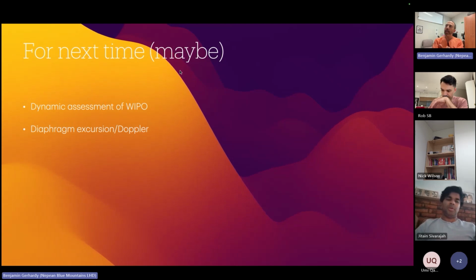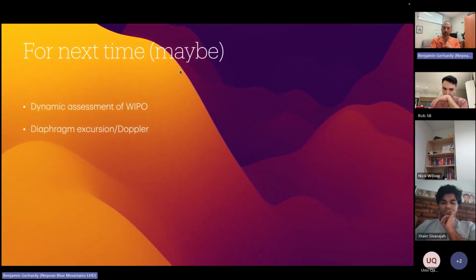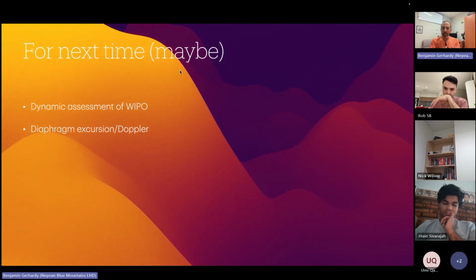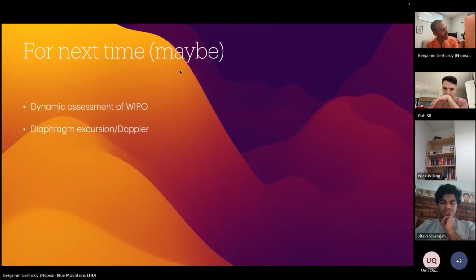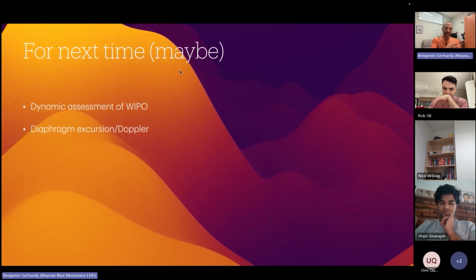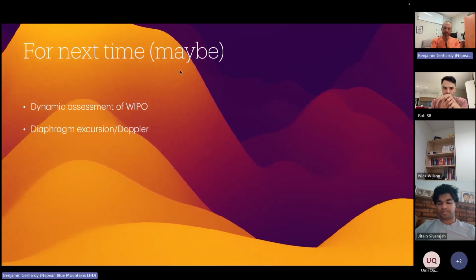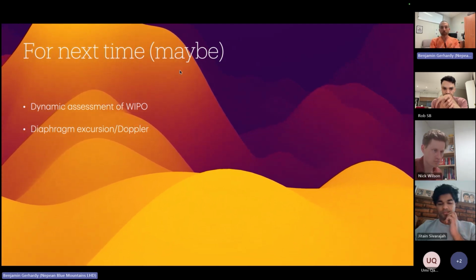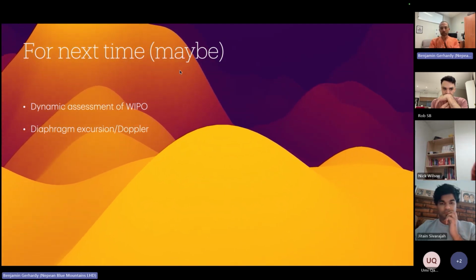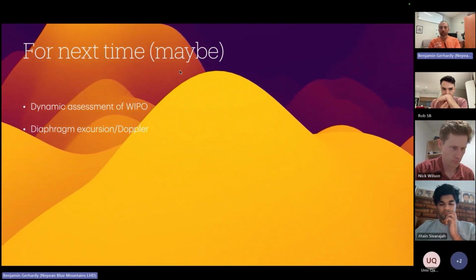The exceptions to that are if they had a really high Wells score, for example, or they just had a lot of features screaming PE, then I'd do a CTPA. Those sorts of diagnoses you still have to think about, because whilst there are some features of PE on ultrasound, you can see a wedge infarct, but a wedge infarct will appear late, it won't appear early in terms of the clot.